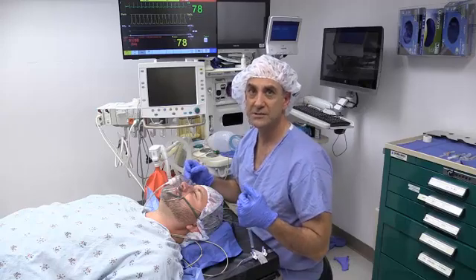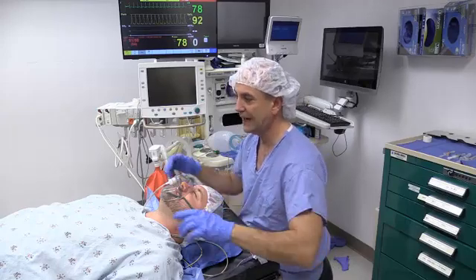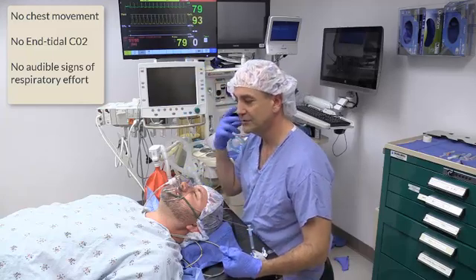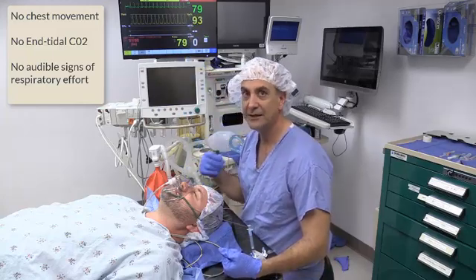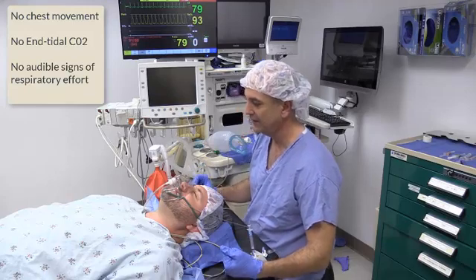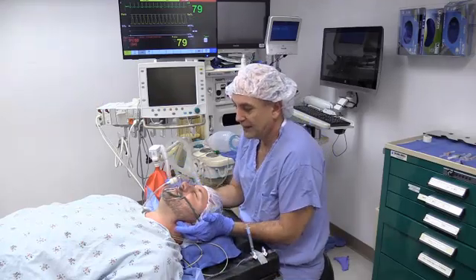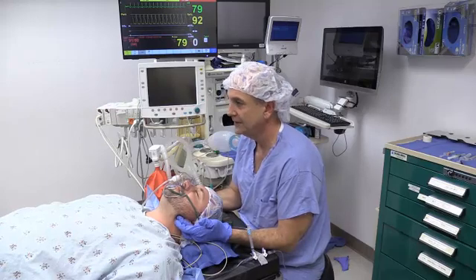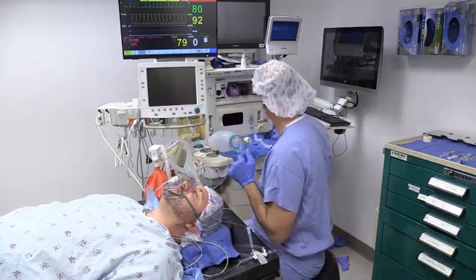Mr. Jones is no longer breathing. He's completely apneic. There is no chest movement, no end-tidal CO2. I do not hear any type of respiratory effort. I'm going to lift up on the angles of the mandible, try to do a head tilt chin lift. Does not appear to be working.